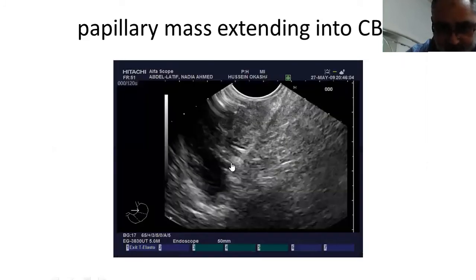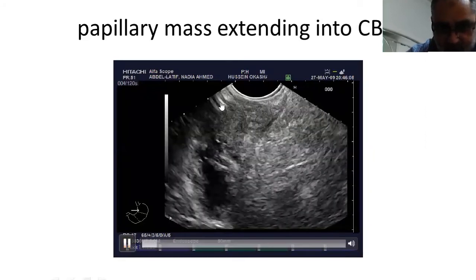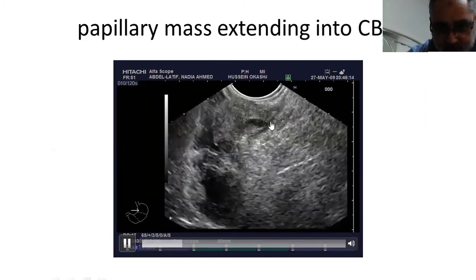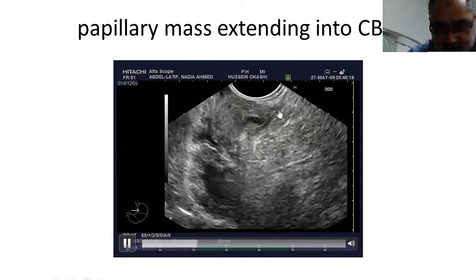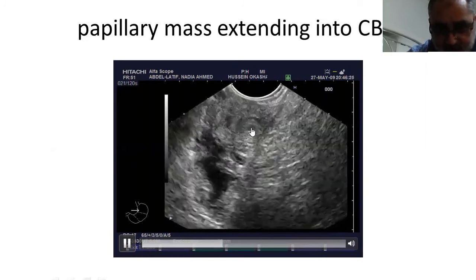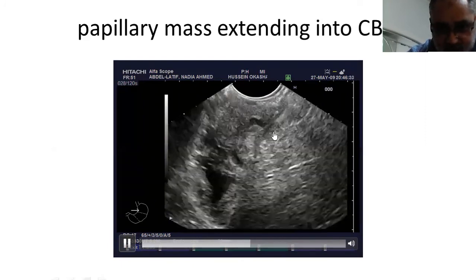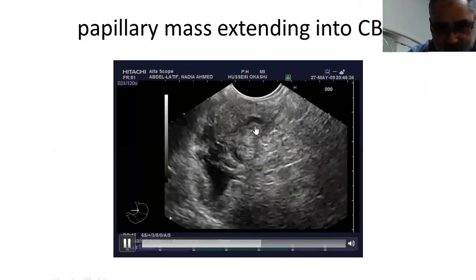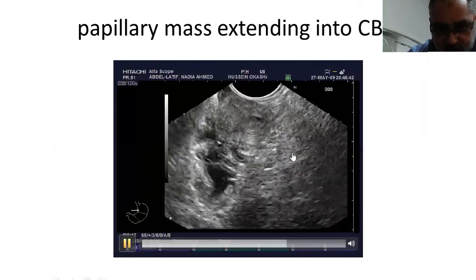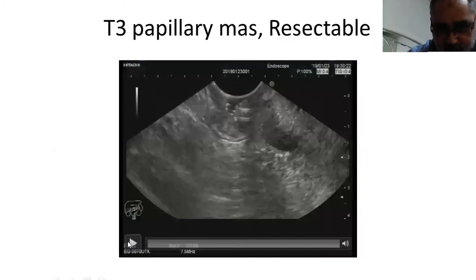This is another example of a well-defined papillary mass located in the lumen of the second part of the duodenum with fluid inside. Here this is a very well-defined muscularis propria layer, so it is respecting the muscularis propria layer of the duodenal wall. And here this is the CBD with a very small soft tissue shadow inside, so there is minimal extension of this papillary mass into the lumen of the common bile duct — less than 1 cm. The muscularis propria is very well respected, so we can do endoscopic ampullectomy to this mass.